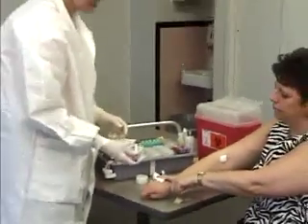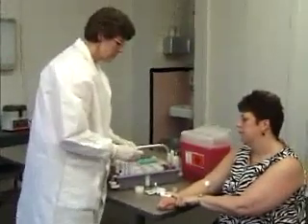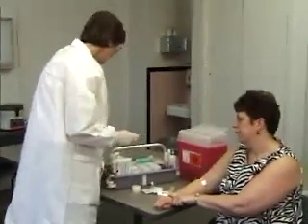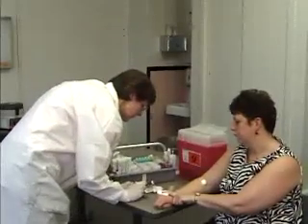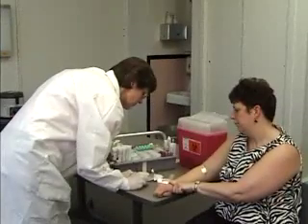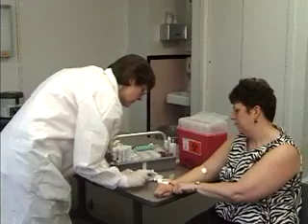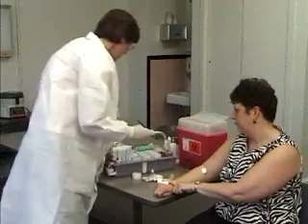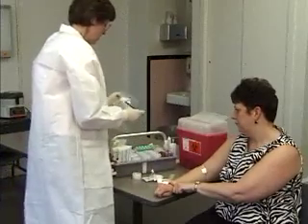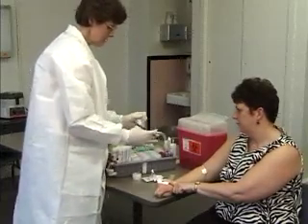Again, I'm going to mix my tube to make sure it's well mixed. I'm going to label my tube: Alice Smith, 75, 24, 63.